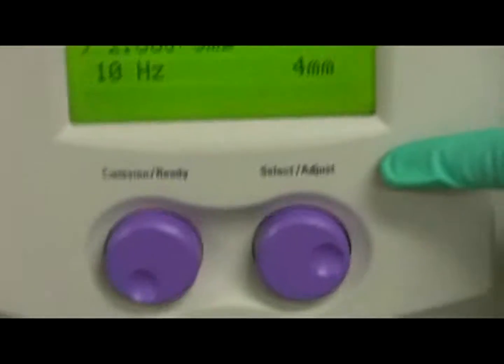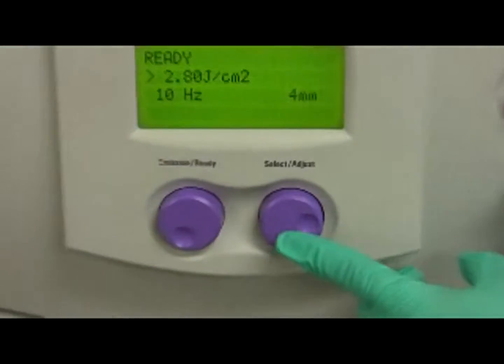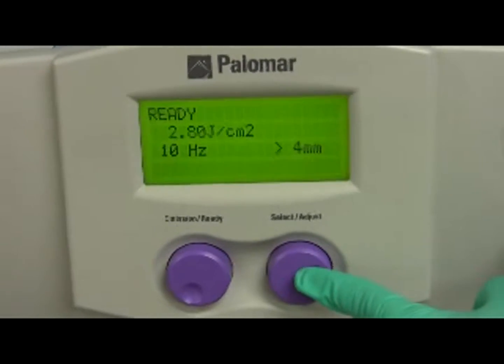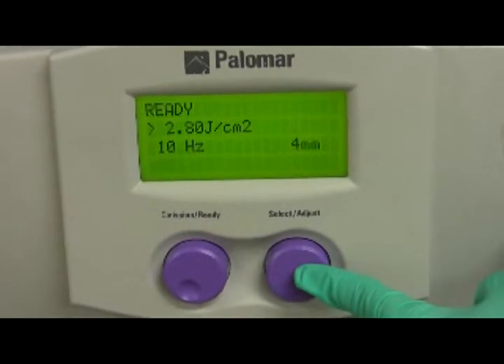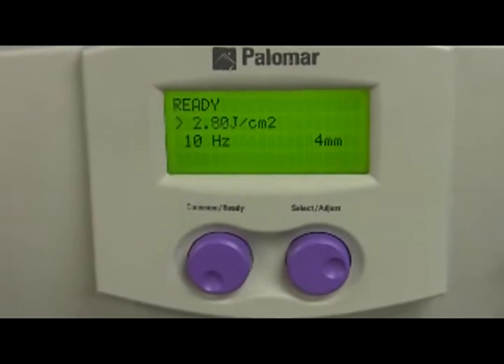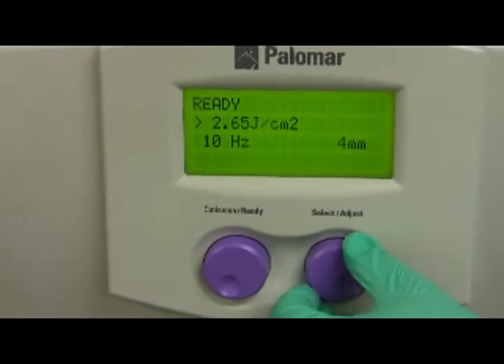Choose the wavelength using the dial above the spot size dial on the handpiece — it's a green and red bar. There are two purple buttons at the front of the machine: one is labeled 'Select/Adjust' and the other is labeled 'Emission Ready.' The selection button is used to select all appropriate settings. To move from one parameter to another, press this button once — you can see the arrow moving. Then it may be turned to adjust each setting: turning right increases the fluence, turning left decreases it.